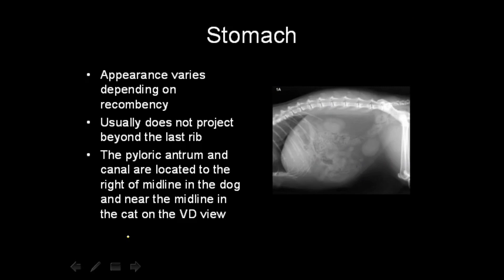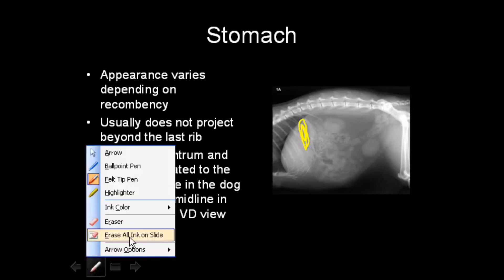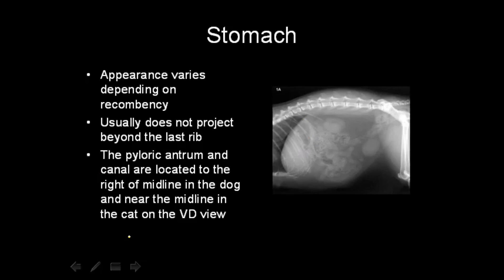In a right lateral view, most of the air goes to the left — the fundus and body of the stomach. This can sometimes be useful to identify torsion. As a rule of thumb, the stomach normally doesn't extend beyond the last rib. If the stomach does extend beyond the last rib, then it is considered dilated.